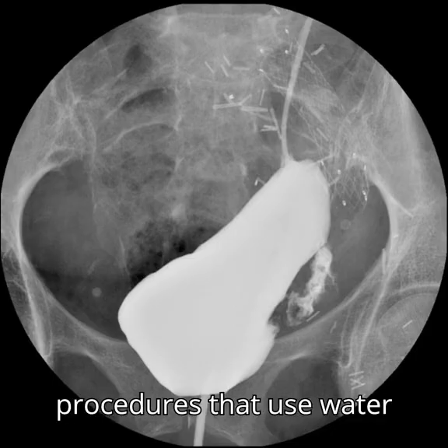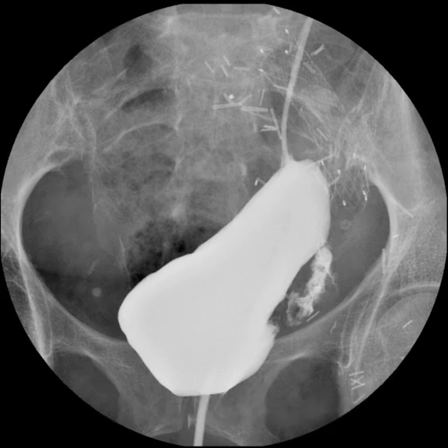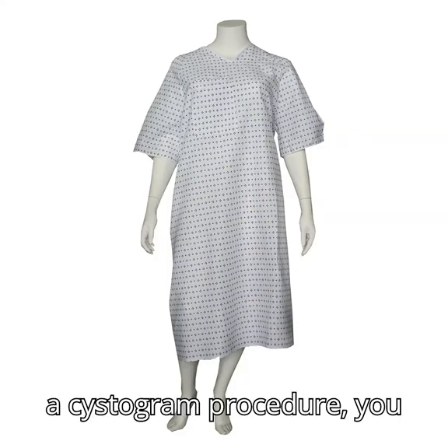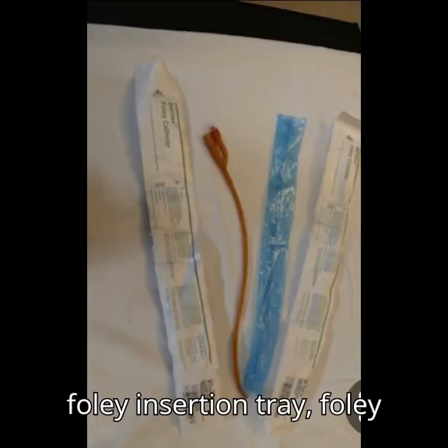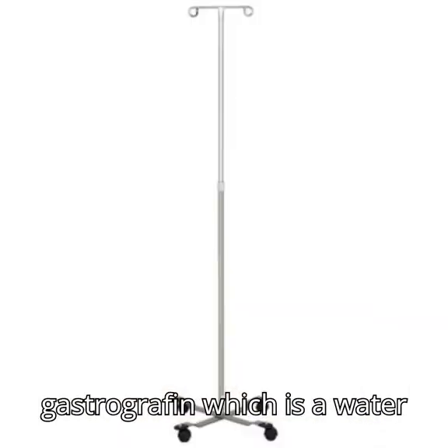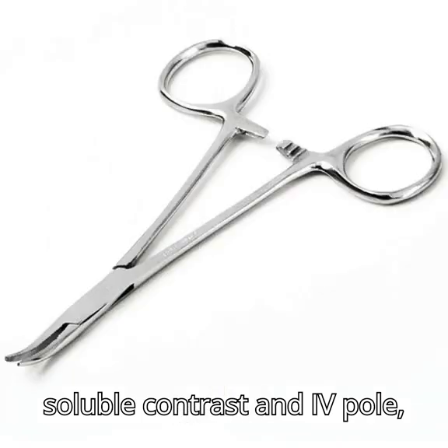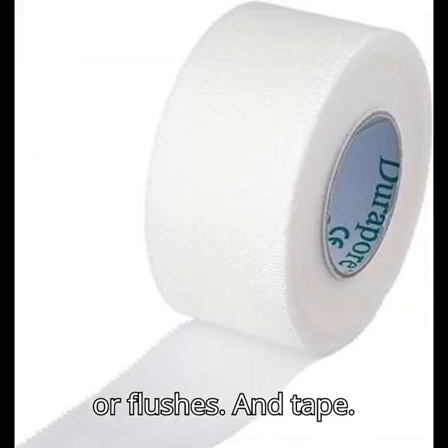Cystograms are fluoroscopic procedures that use water-soluble contrast to visualize the bladder. To set up the room for a cystogram procedure, you will need a patient gown, Foley insertion tray, Foley catheter, cystogram tray, gastrographin, which is a water-soluble contrast, an IV pole, hemostats, chucks, syringes or flushes, and tape.